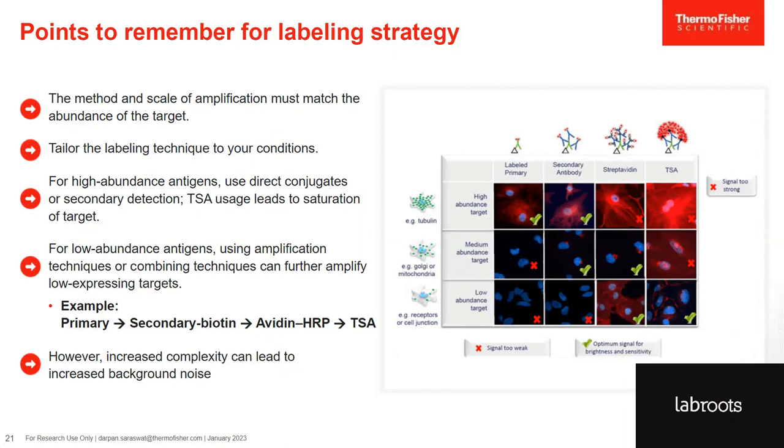You have to find the right balance. With every additional detection step, you are increasing the risk of background due to endogenous components, non-specific protein binding, or non-specific dye charge binding.